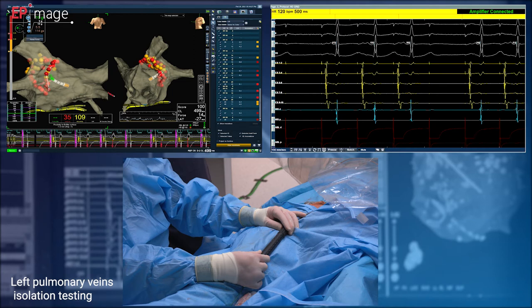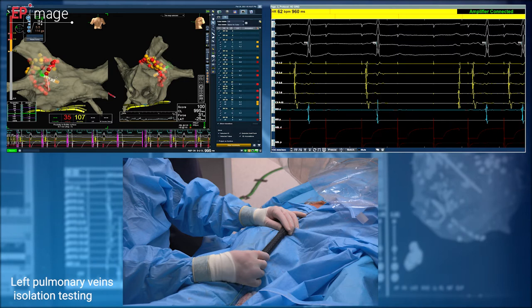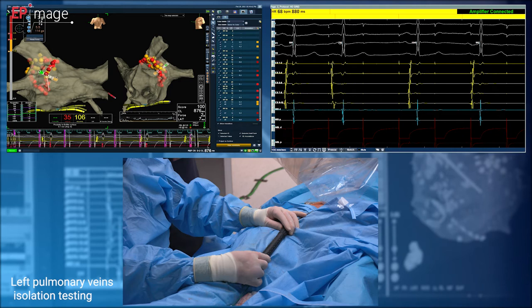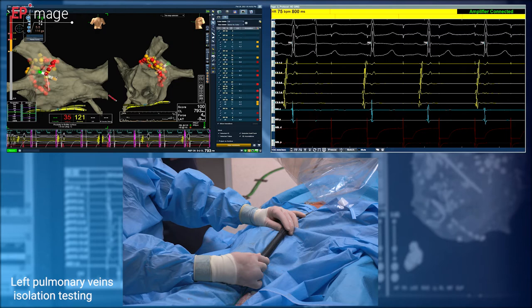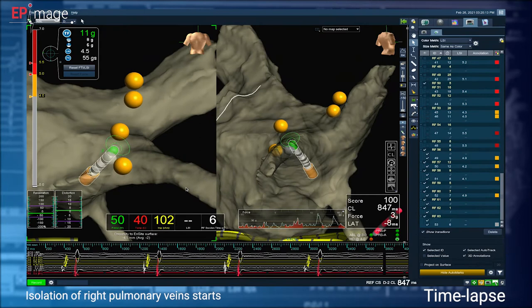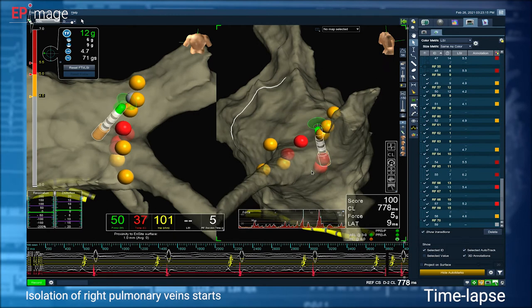Now I'm checking again. You see these signals are captured now, but I'm on the posterior wall just behind the ablation line. When I'm getting inside the region which should be isolated, the capture, despite a good contact, is not captured. So we have the proof that left pulmonary veins are isolated. Now we'll move to right pulmonary veins, and again we'll show it in accelerated mode.